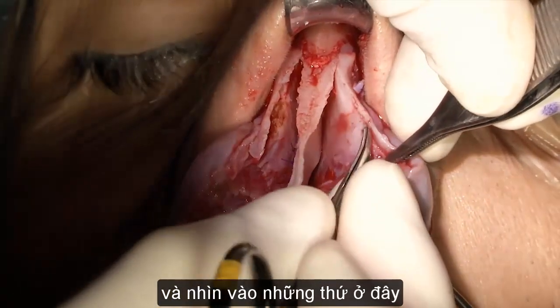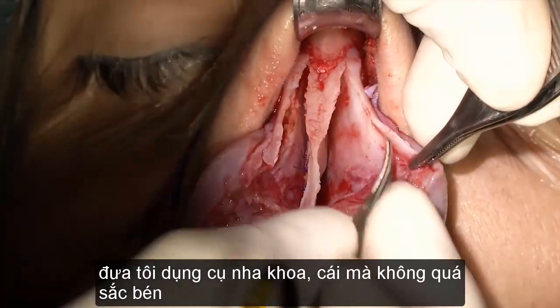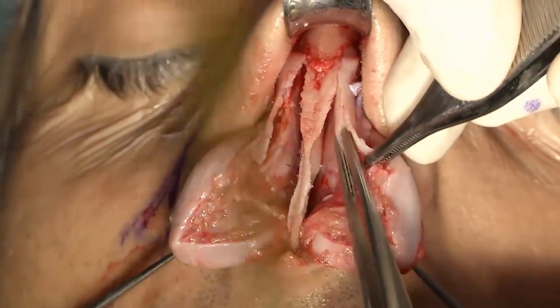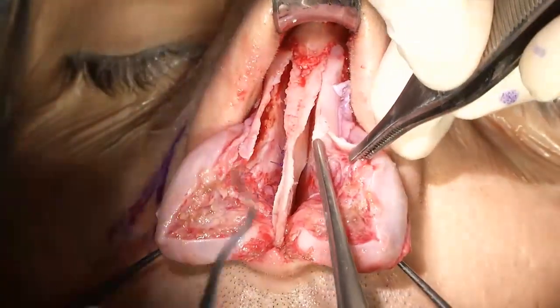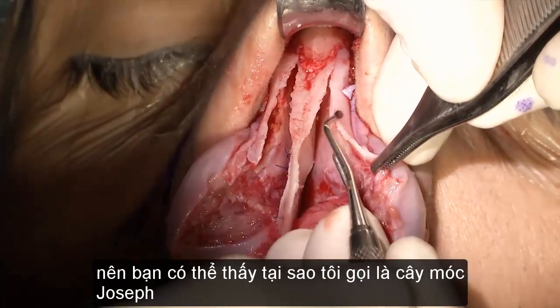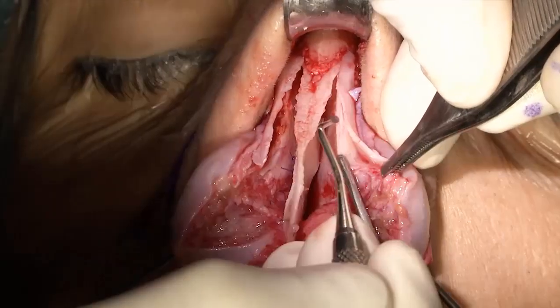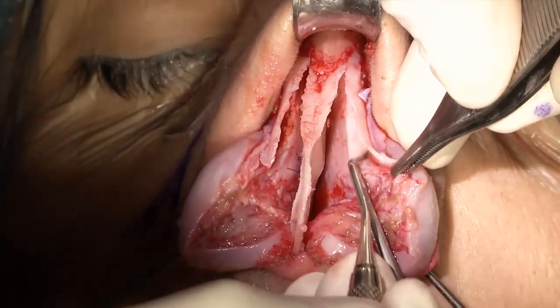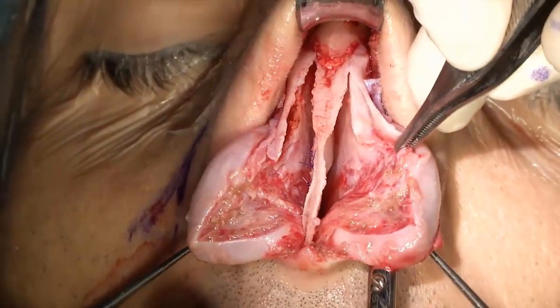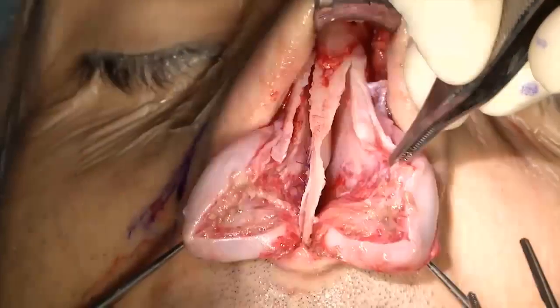So see this thing here? Give me my dental thing. This is not sharp enough. So you can see why I call, if you think of a Joseph elevator, it's Jurassic really. So that's a demonstration pretty clear of bringing this mucosa, letting this mucosa down a little bit.